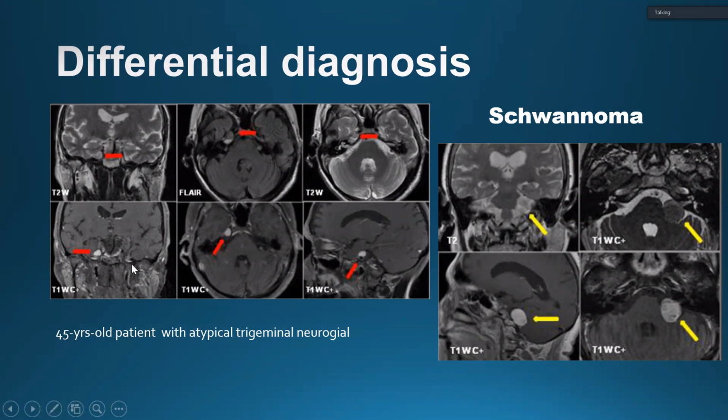So okay. So we ask the technician to make the sequence that fuses these two sequences. Yeah. You can do it yourself, or the technician can do it for you.